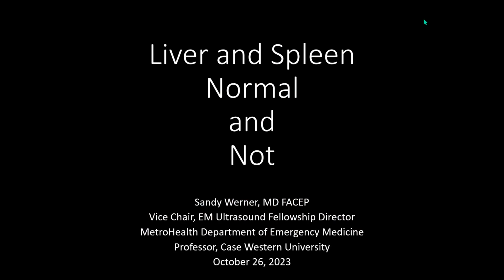I'm Sandy Werner, and I am going to be talking about the liver and the spleen, normal and not. And, you know, we do FAST exams and we look at the liver, sort of. We're really looking for free fluid around it, above it, below it. We don't really look at the liver. And the same thing with the spleen. But sometimes you see these incidental findings and you're like, what am I looking at? And do I need to do anything more about it?